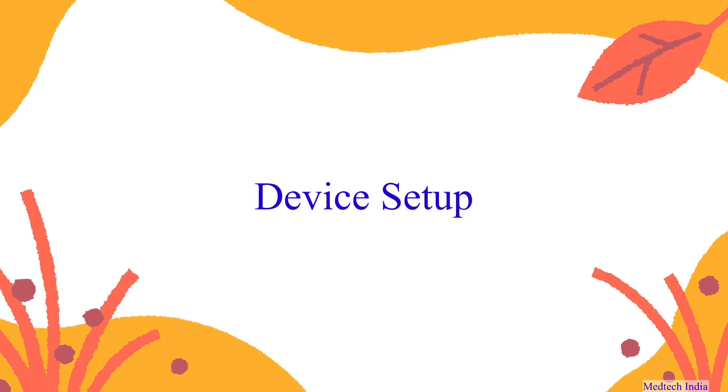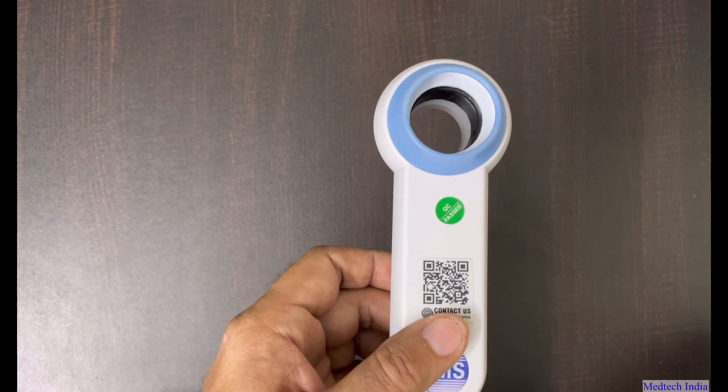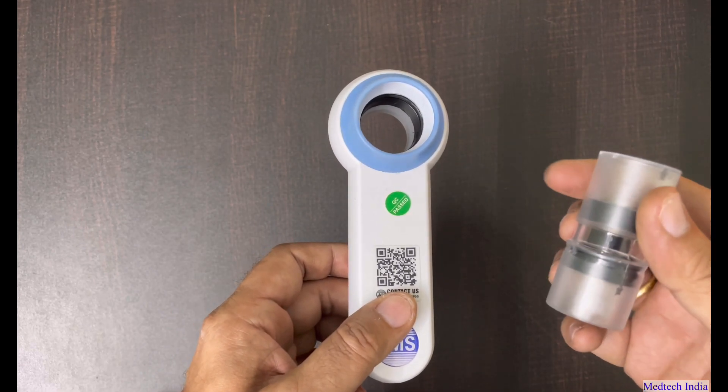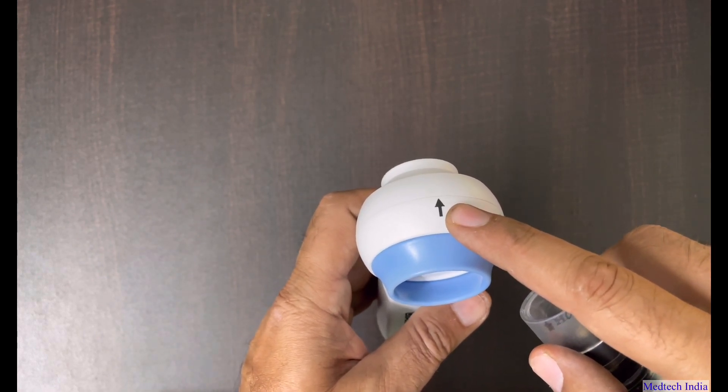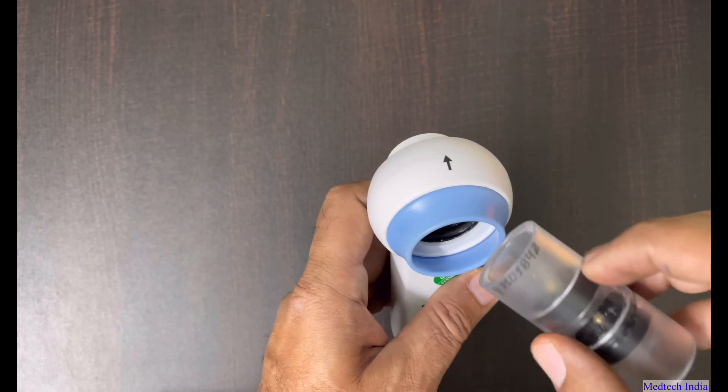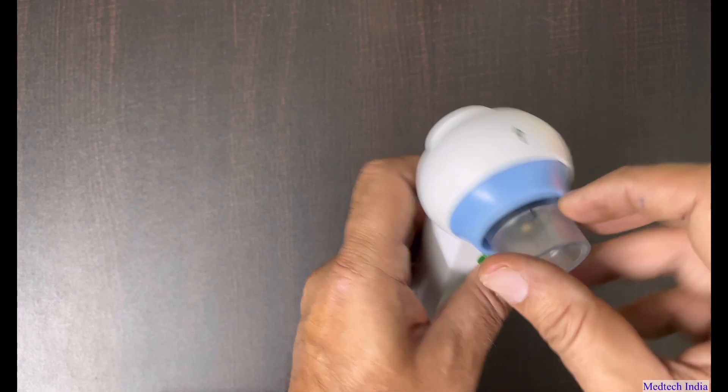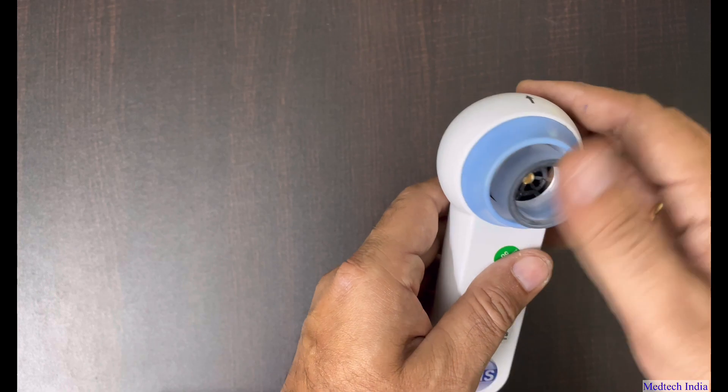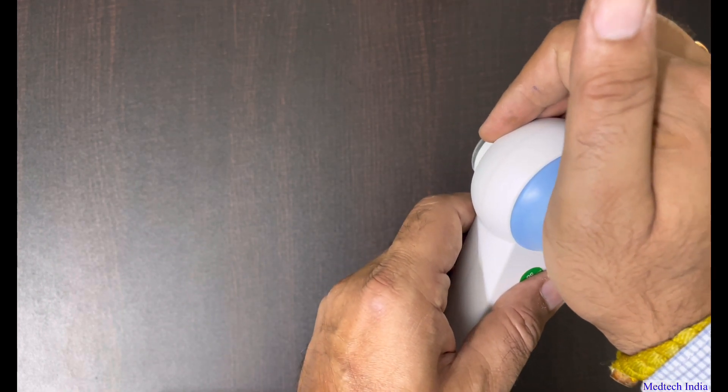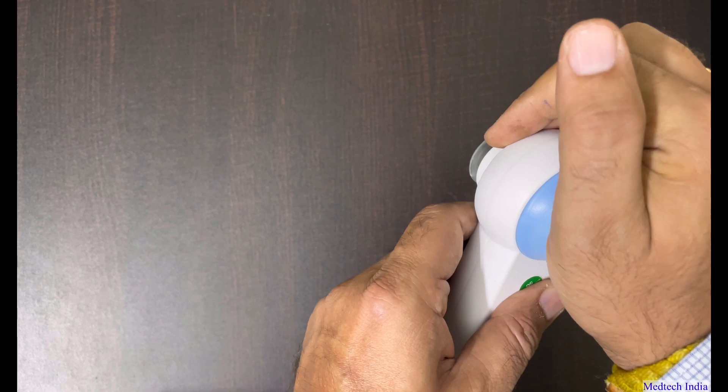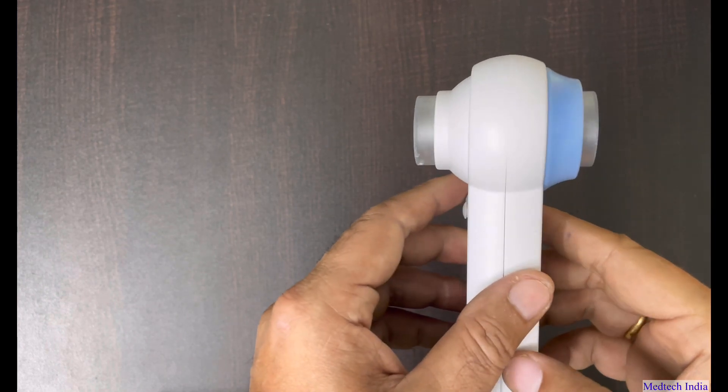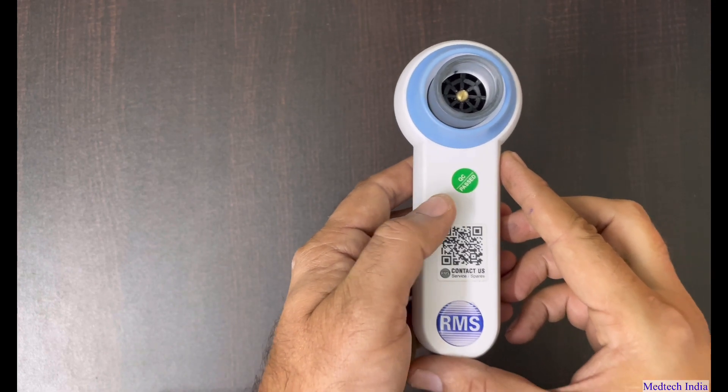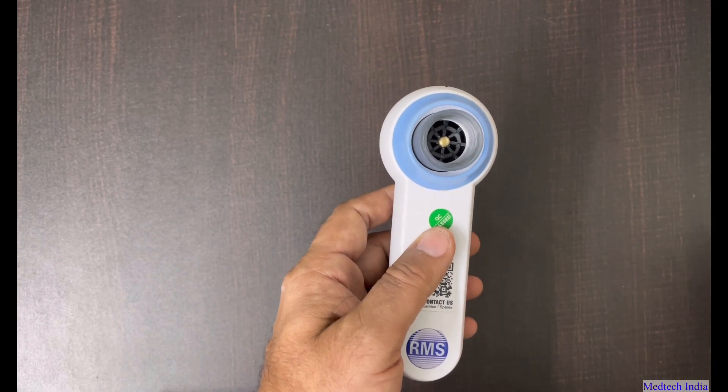Hello friends. Now we will start device setup. Our first step is to fix the turbine inside the handle. As we can see, the arrow marks are mentioned on the handset as well as on turbine. We need to fix the turbine in arrow direction only. Please push the turbine inside the handle with your palm. You will get one tuck sound. It means your turbine is now properly fitted inside the handset.